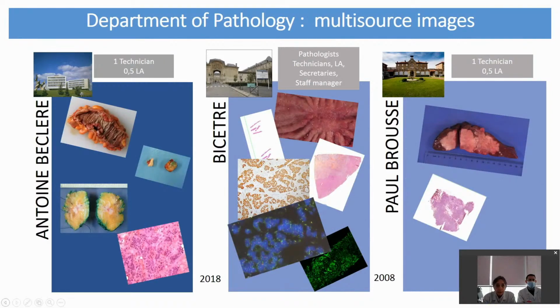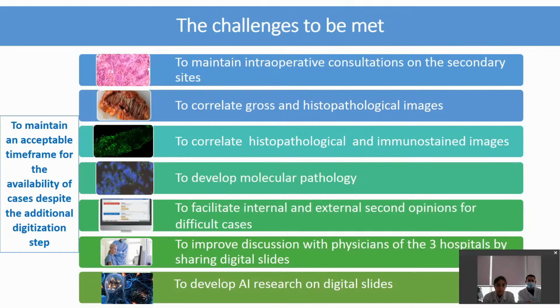Thus, the department has to manage together multi-source and multi-format images: gross images, frozen section digital slides, stain and immunostain digital slides, which are managed through our IMS Scalopix connected with our LIS Daedalus. Immunofluorescence and in situ hybridization digital slides are managed independently through Case Viewer and visualized with Case Center.